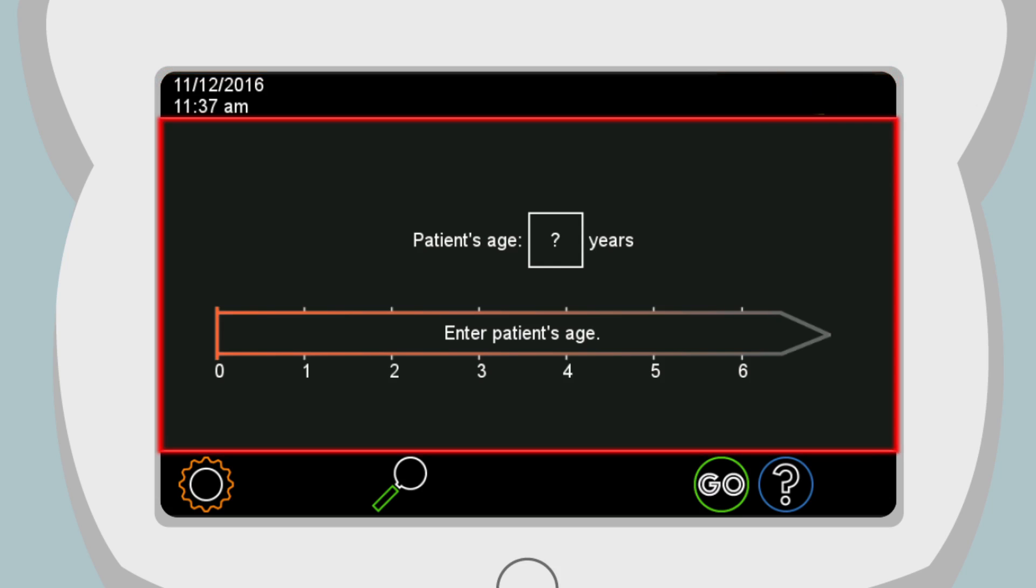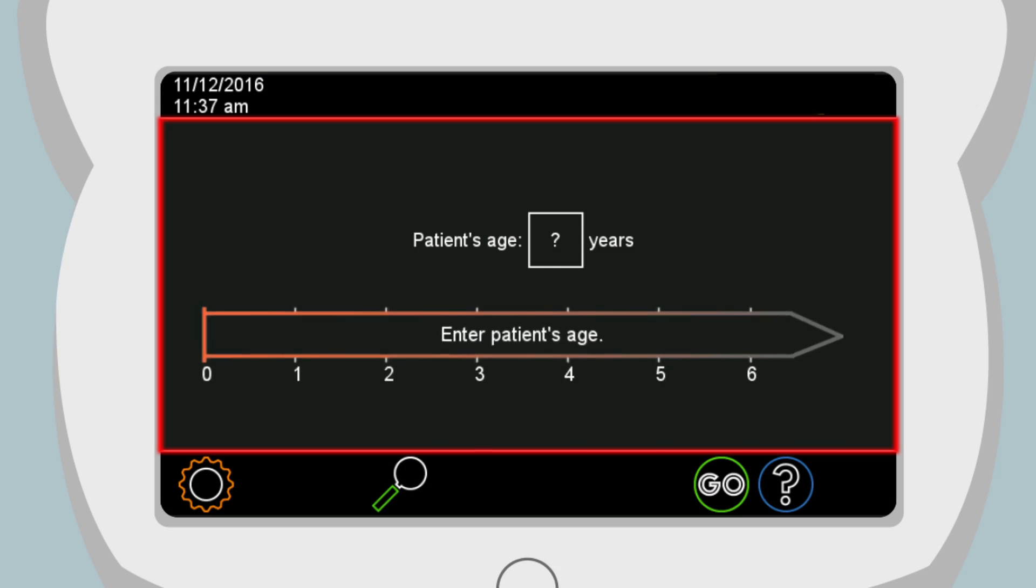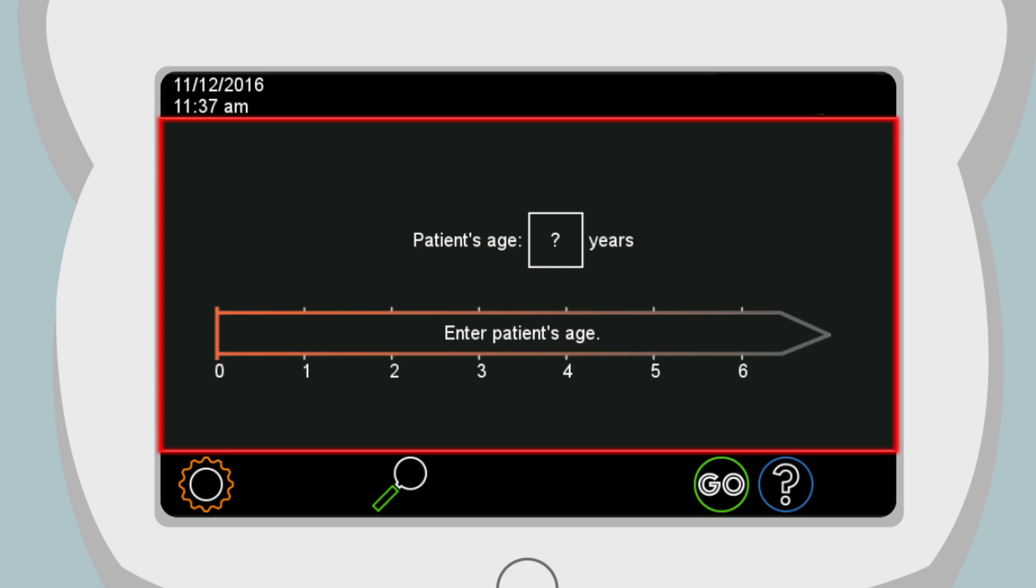The information section is where the main body of content is located. Shown here on the home page, the information section contains a timeline for a patient's age and years. The referral criteria are age-based, which is why it is very important to choose the correct age group.